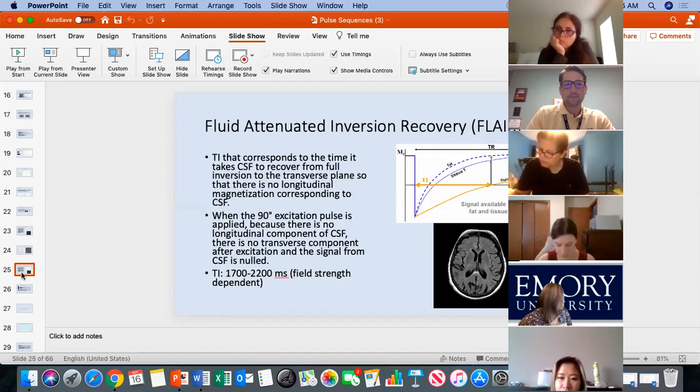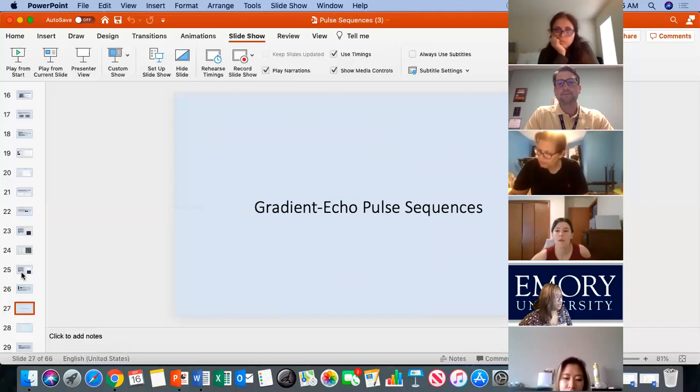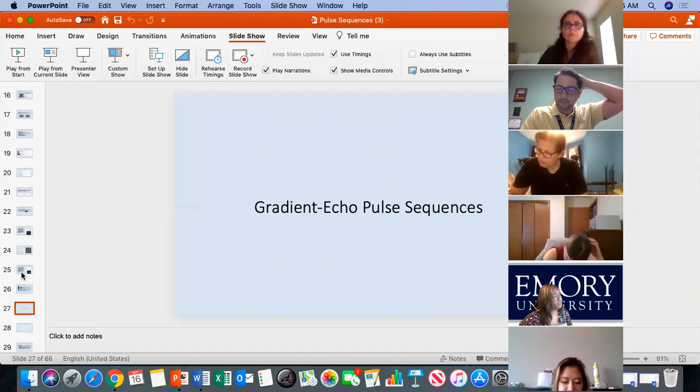Yes, thank you. Okay. I have a quick question about running a STIR. I know that I'm worried about metal susceptibility when they have fusion in the spine. Sometimes we'll run a STIR because they're saying that if we were to run the other one, it just really would give us a horrible picture. So do we also run it for metal susceptibilities?